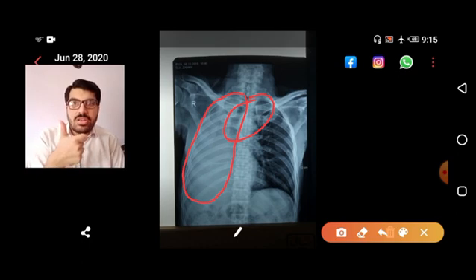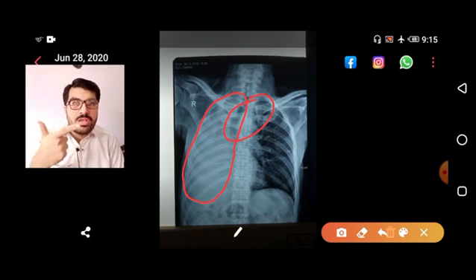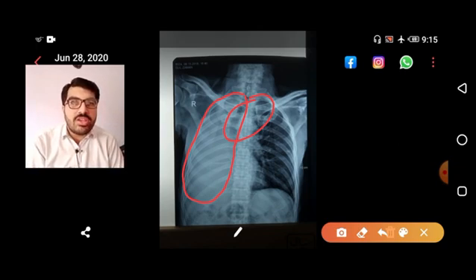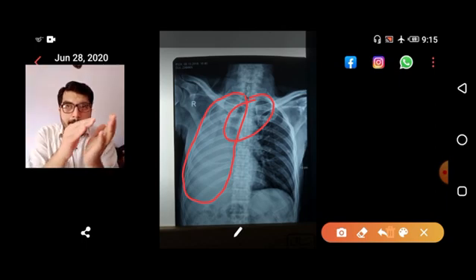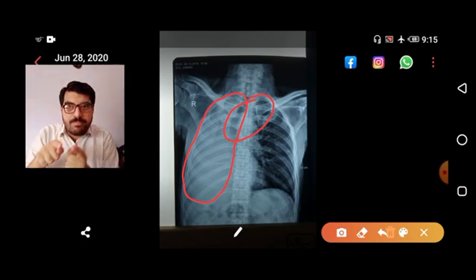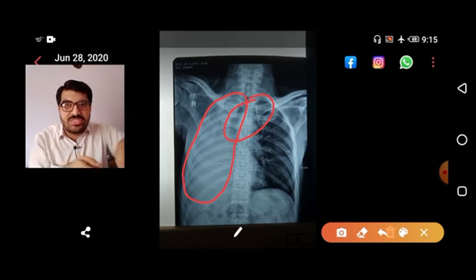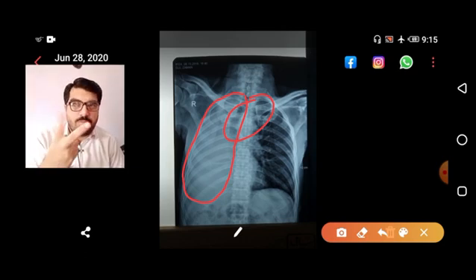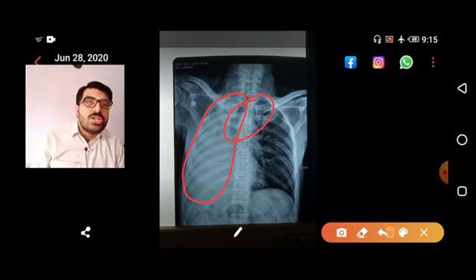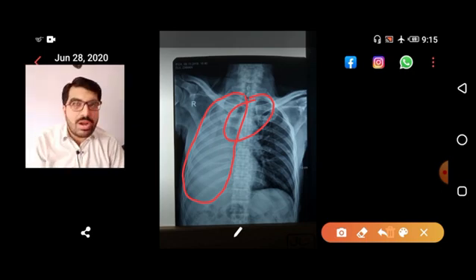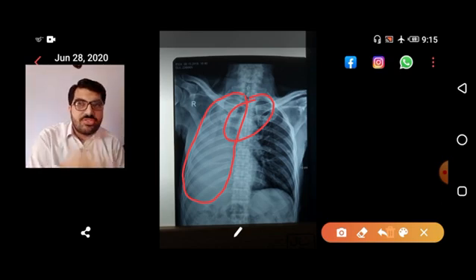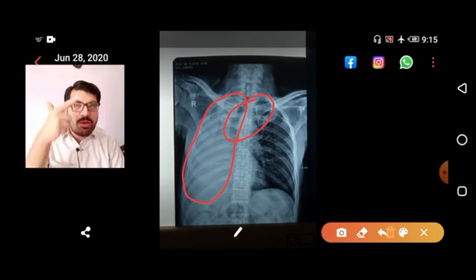In lung collapse, the trachea shows a smooth deviation. In pneumectomy, you see 'hooking' of the trachea — a hooked deviation rather than a smooth one. Hooking of the trachea is seen in fibrosis and previous pneumectomy. This X-ray looks more like previous pneumectomy, but keep both differentials in mind: lung collapse and previous pneumectomy.